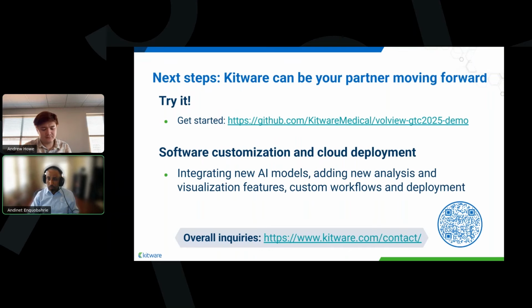So just to wrap up, if today's presentation, webinar, and demo was interesting to you, and if AI-assisted imaging, multimodal workflows, and custom integration are something you're really interested in, we wanted to suggest some next steps. You can go to the Kitware Medical organization on GitHub, clone the repository, build it and run it on your machine. That's actually the best way to give it a try.